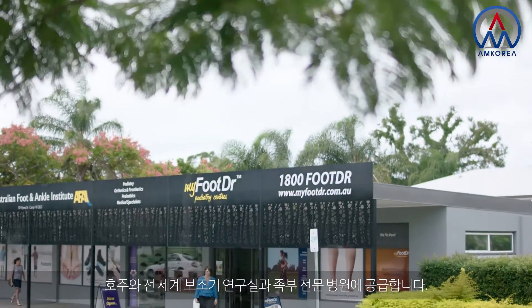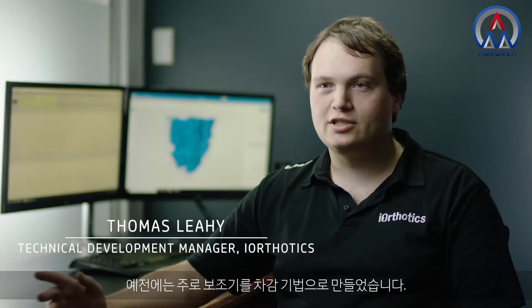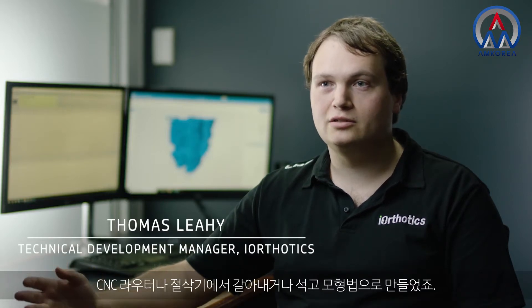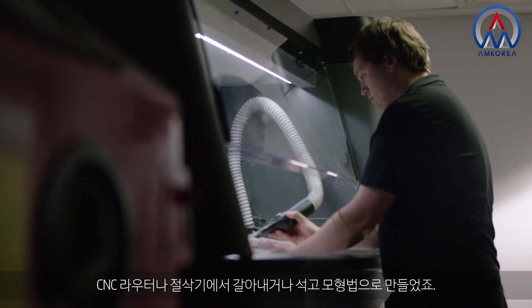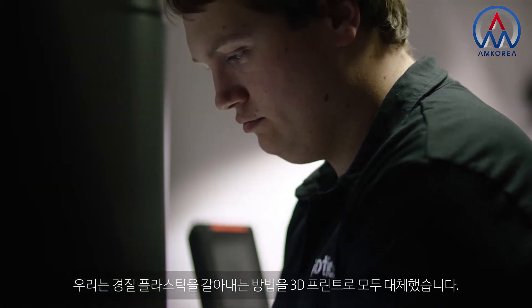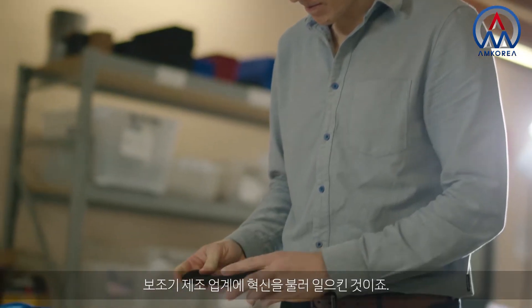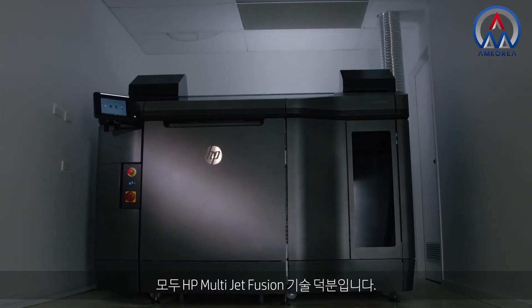At iOthotics we manufacture custom-made foot orthotics for orthotic labs and podiatry clinics, both in Australia and around the world. Traditionally orthotics are made using subtractive methods, which is either milled on a CNC router or milling machine, or the plaster cast method. We've done away with the milling of hard plastics and we just 3D print all our hard plastics. We're proud to be innovating in the orthotic manufacturing industry using the HP MultiJet Fusion technology.